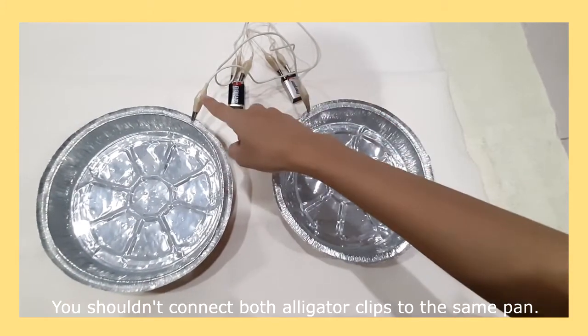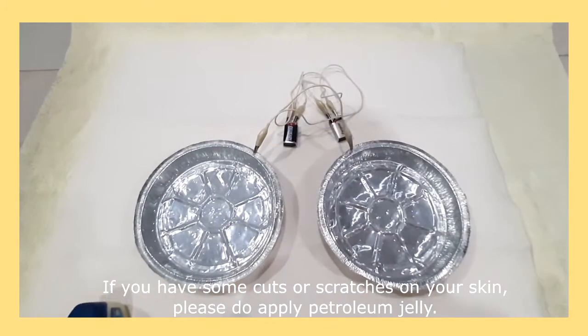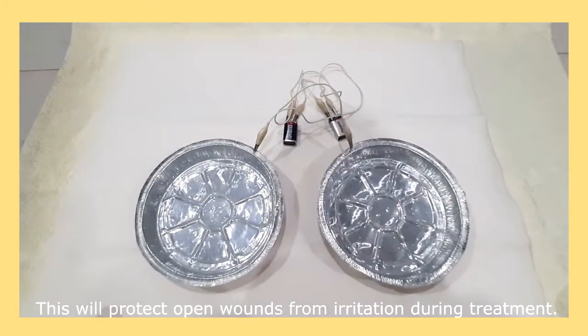Third, you should not connect both alligator clips to the same pan. Fourth, if you have cuts or scratches on your skin, please do apply petroleum jelly — this will protect open wounds from irritation during treatment.